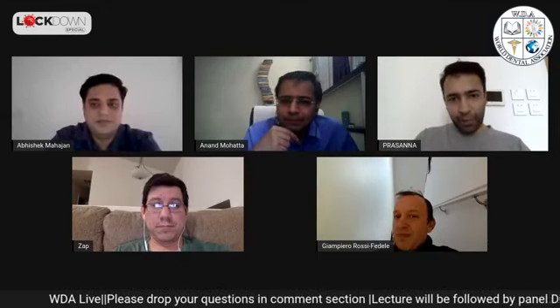One thing which probably Giampiero knows is my take on this. I try to usually differentiate agitation from activation, although there is no clear literature to talk about that. From the activation perspective, ultrasonic definitely activates irrigants chemically, whereas sonic is not an effective medium there. But regardless, the take-home message should be that activation is important considering how complex the anatomy is. There are a lot of variables that we can change, but one thing which we cannot change is the anatomy. And considering the complex anatomy, activation probably is important.